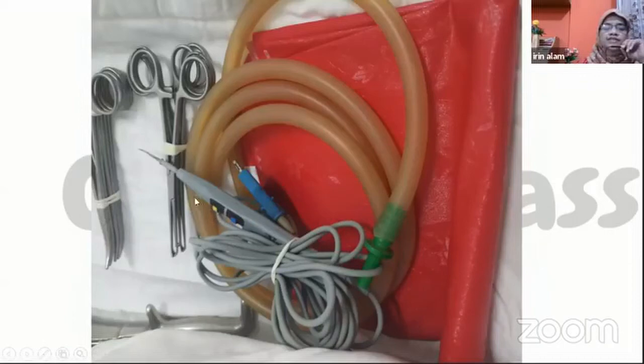If we push this, then tissue will be cut. It is attached to the electricity and the tissue will be cut. And if we push this, the tissue will be coagulated. If there is bleeding from small bleeding vessels, we coagulate with this. We coagulate by pushing this instrument button, and the bleeding vessel will be obliterated by coagulation.